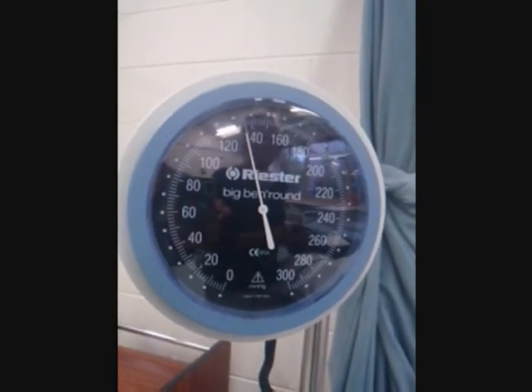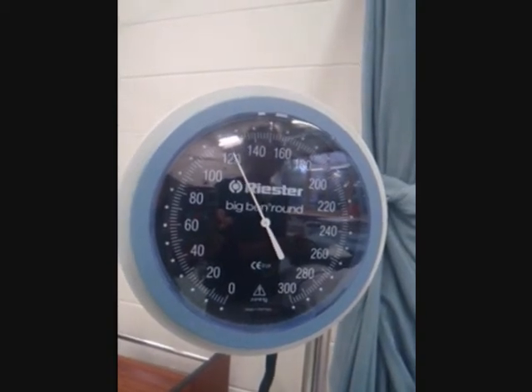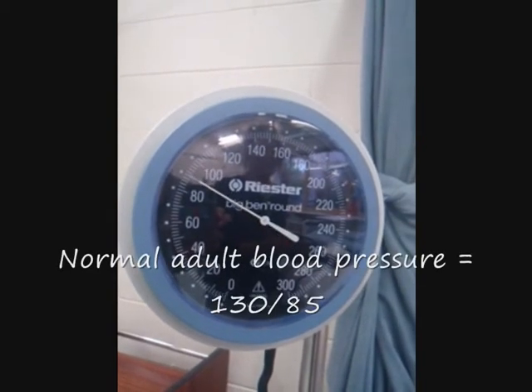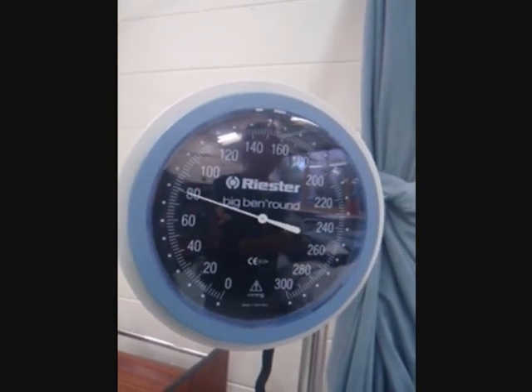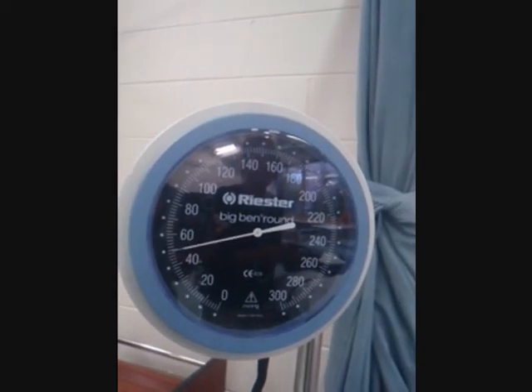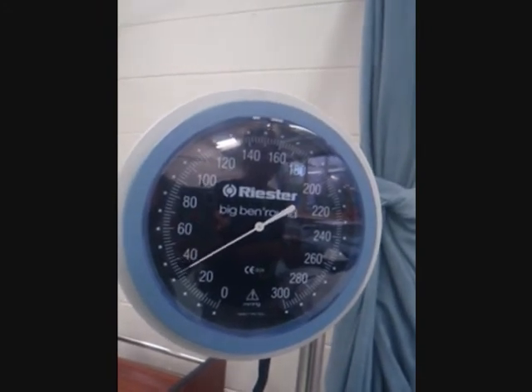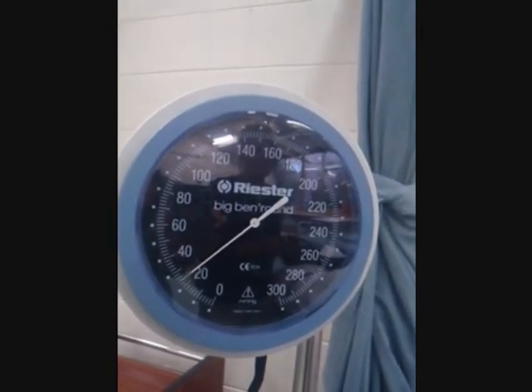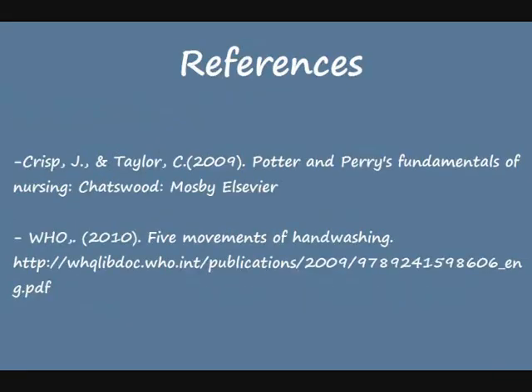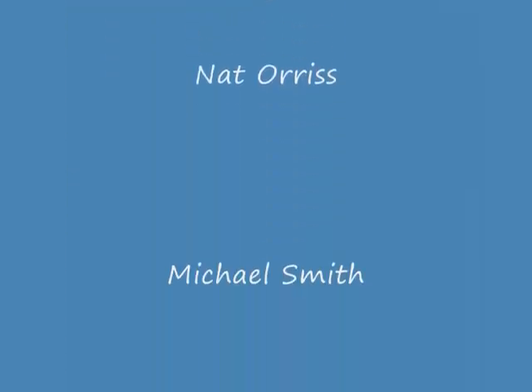Slowly loosen the pressure valve and allow the needle to fall at a rate of 2–3 mmHg. Note the point on the manometer when the first clear sound is heard — this is the systolic reading. Continue to deflate the cuff gradually, noting the point at which the sound disappears — this is the diastolic reading. Continue to deflate at a more rapid rate.